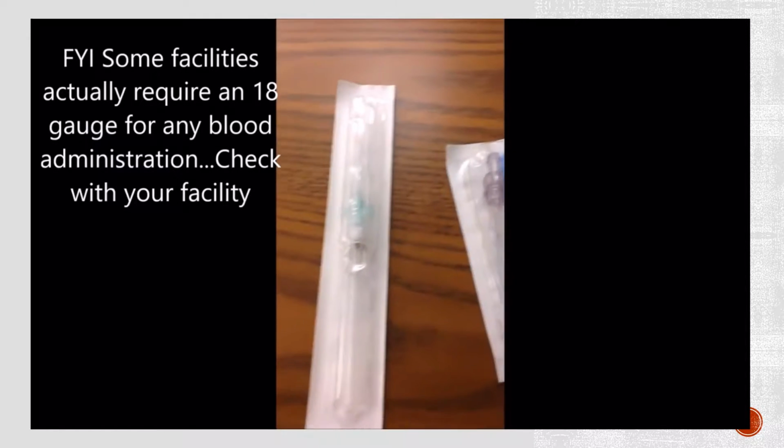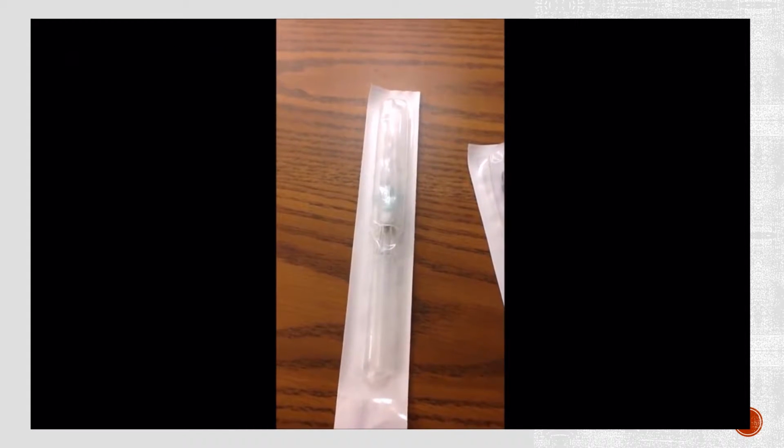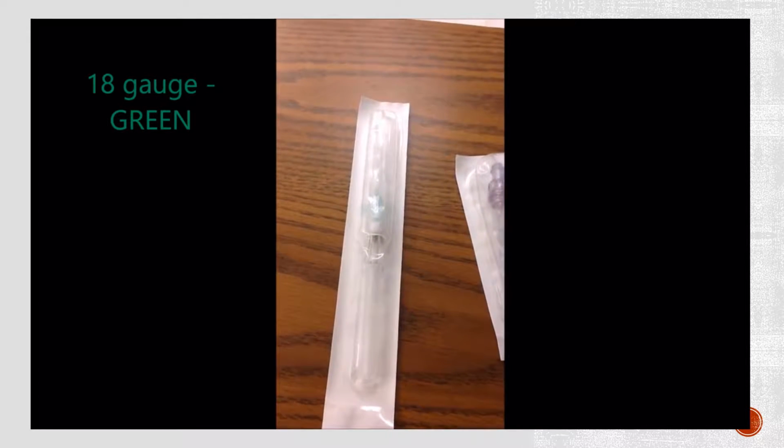And this is an 18 gauge. This is the biggest one we have on the acute care floor. There are bigger gauges that you'll find in the emergency room, but this is generally the one that is started in trauma situations.